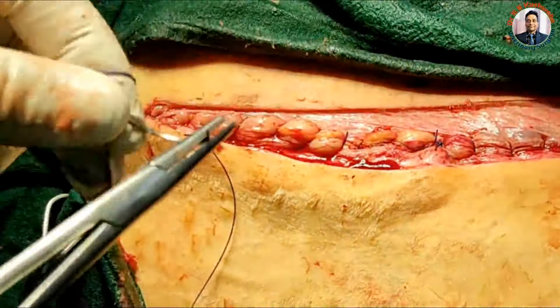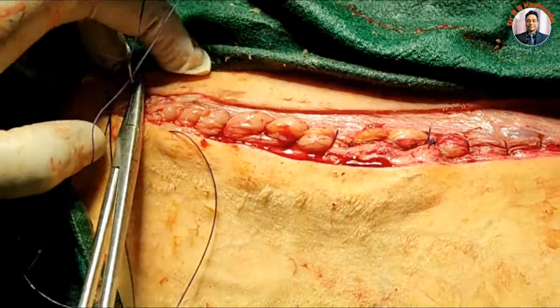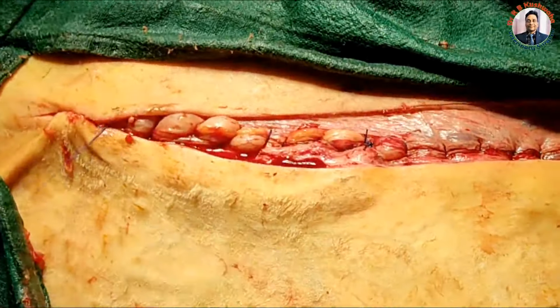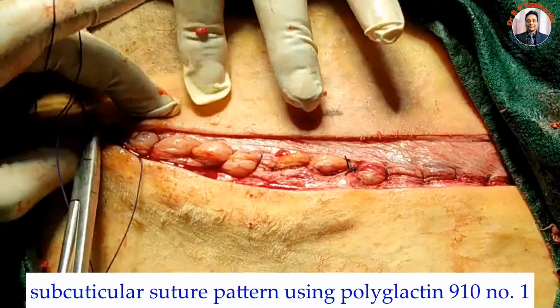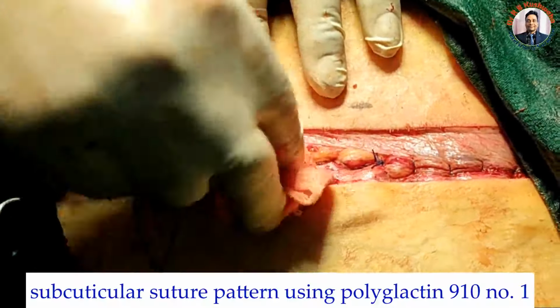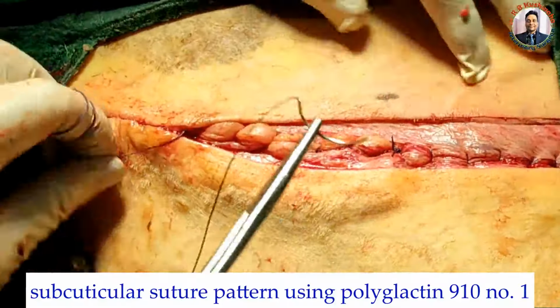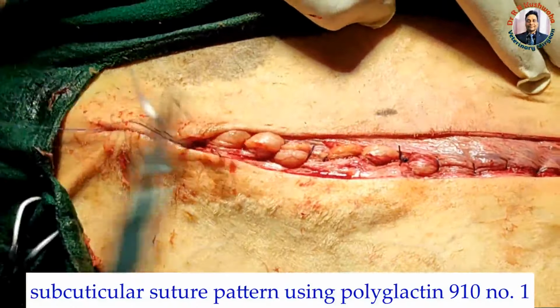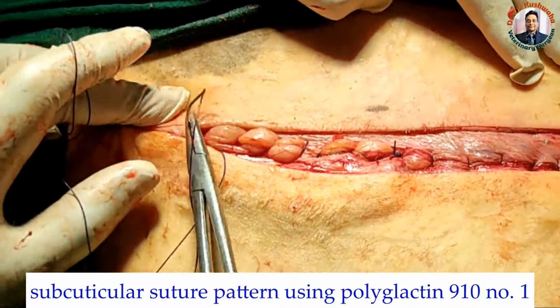So this subcuticular suture pattern obliterates the dead space further and brings the edges together. So this is the reason why I prefer this subcuticular, whether in small animal or large animal. But I have seen so many surgeons who do not apply this subcuticular and go straight to the skin suturing. So it is the surgeon's choice.